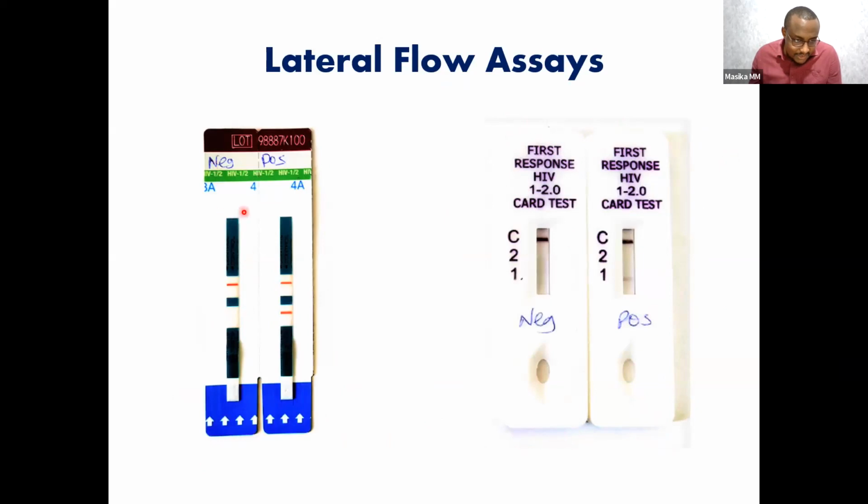Here, you can see the assay structure is exposed completely, where you put the sample on this white space, and then there's an area here that is loaded with a conjugate and maybe some antibodies, and then the space here on the nitrocellulose membrane, the white area, is where you have your target test. If you're looking for antibodies, it will be an antigen for HIV. And so if this sample has antibodies, it will react and give you a positive like one on this strip. And then the last thing here is a control. It will basically react with human blood. So it is very general, able to react with any human sample, so that it can tell you if the sample has crossed all the way to the reservoir. The thing at the end here will absorb any extra sample.